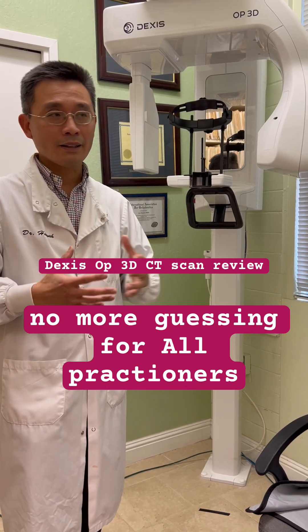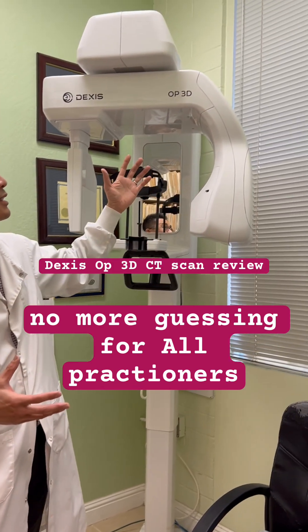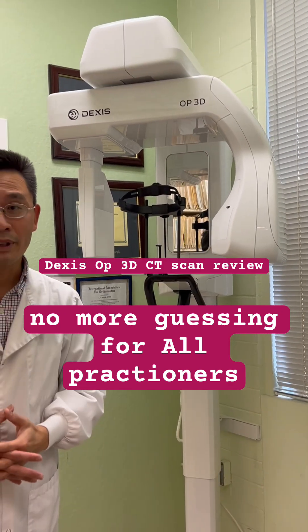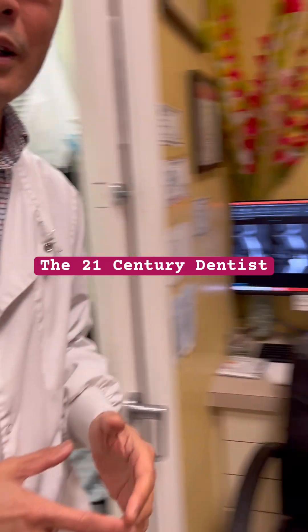It can be very simple, but it can be complicated. Without this DEXIS OP 3D, I would be missing out on something. So I want to show you really what I'm talking about.